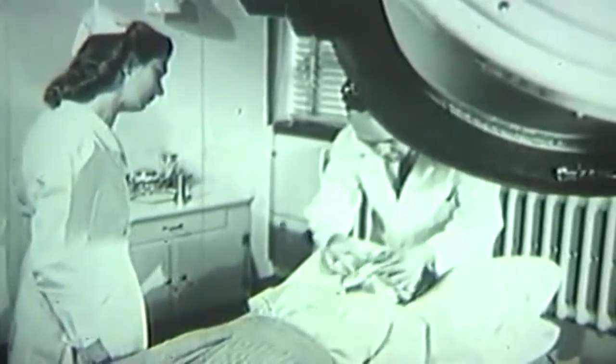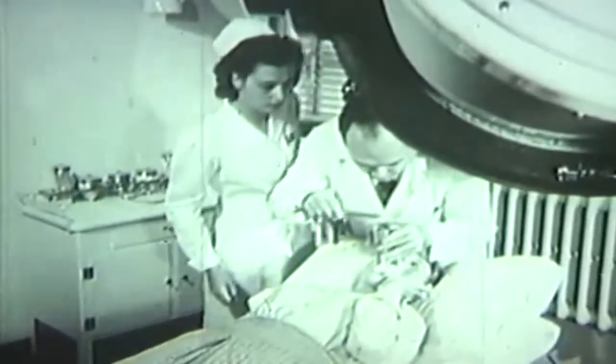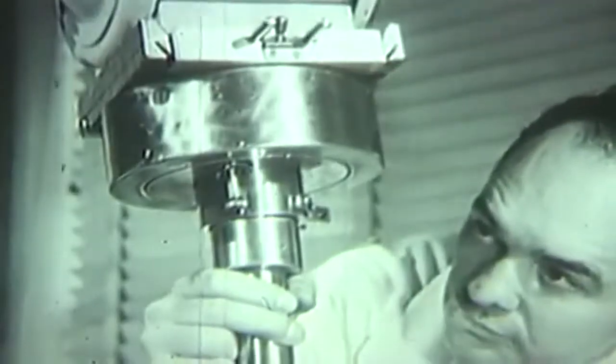The doctor holds the tongue in position with gauze. The technician gives him the clean cone he had previously selected for Mrs. Gordon's treatment. A flashlight provides a preliminary check of the accuracy of its placement. The doctor holds the cone in place as the technician slowly and carefully raises the table until the cone can be connected to the X-ray machine.